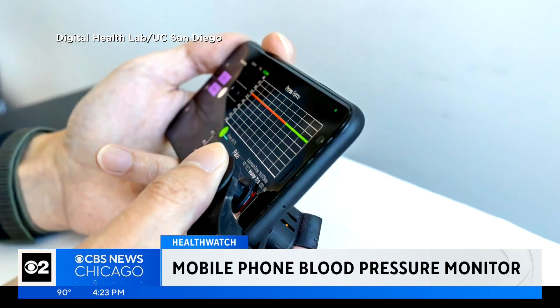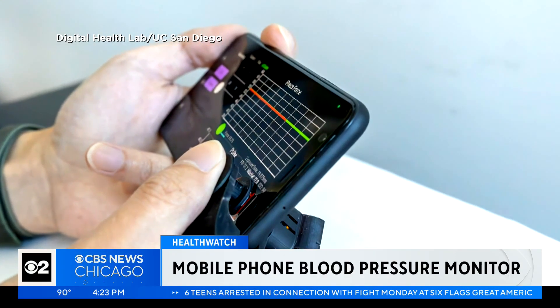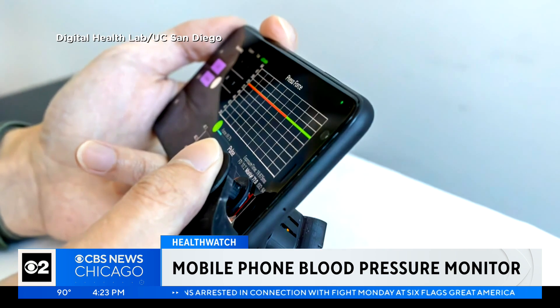See that clip at the bottom corner of that mobile phone? It's an inexpensive way to monitor your blood pressure. Scientists in California just invented it. CBS 2's Astrid Martinez explains how it works.